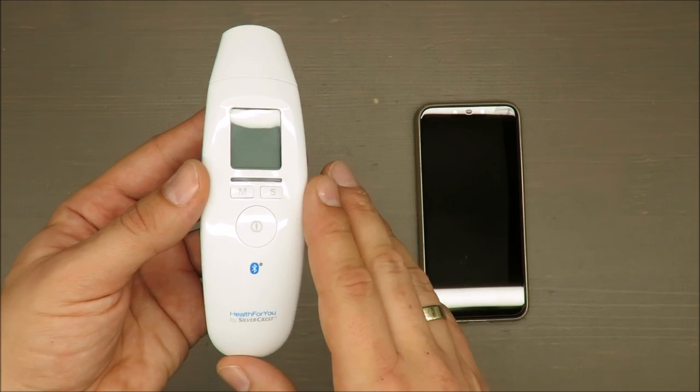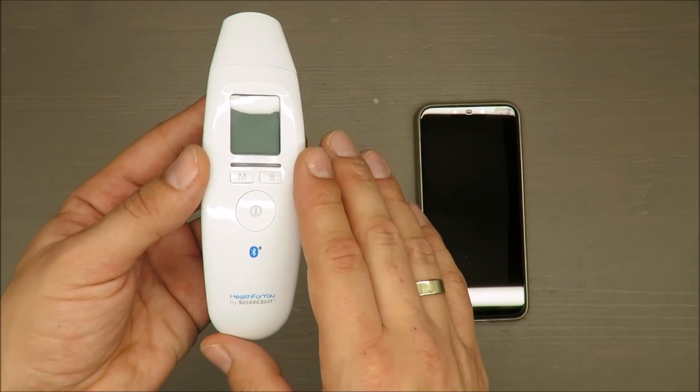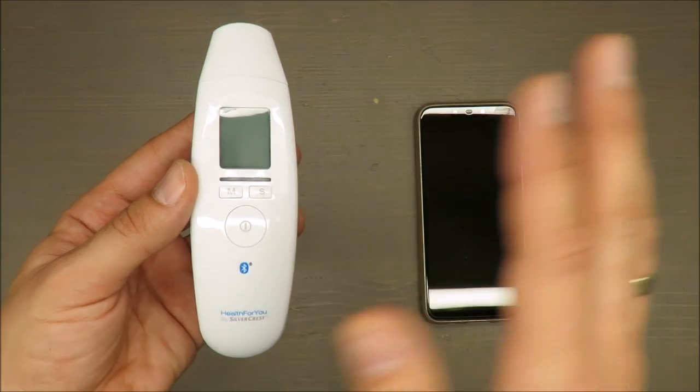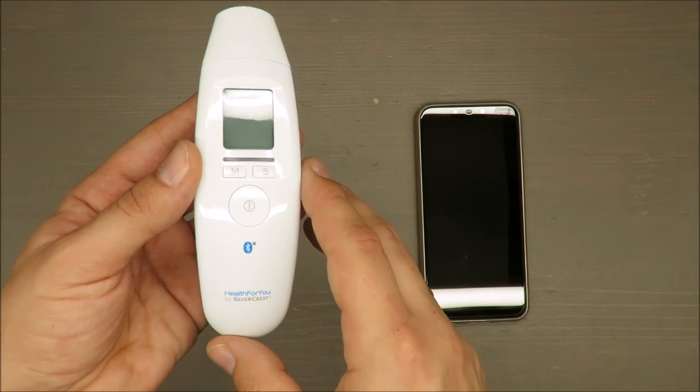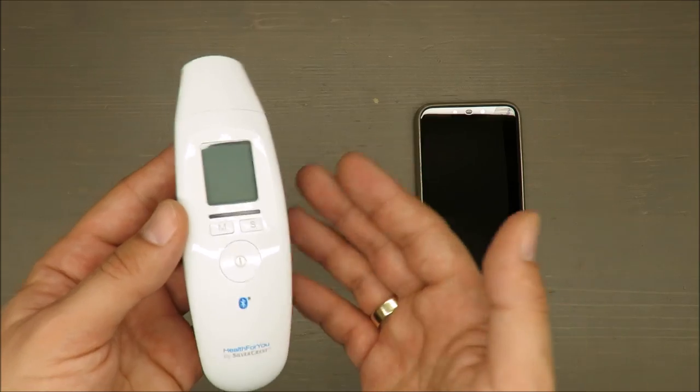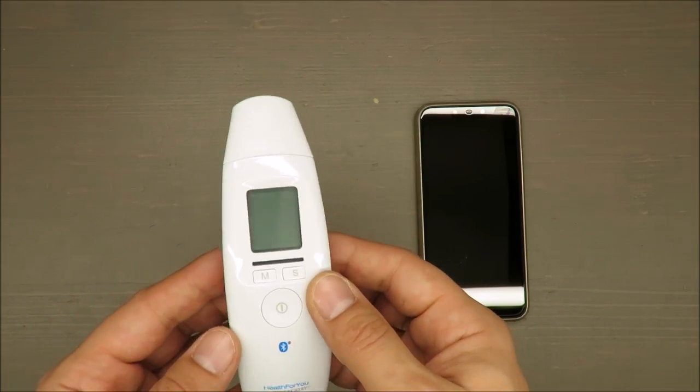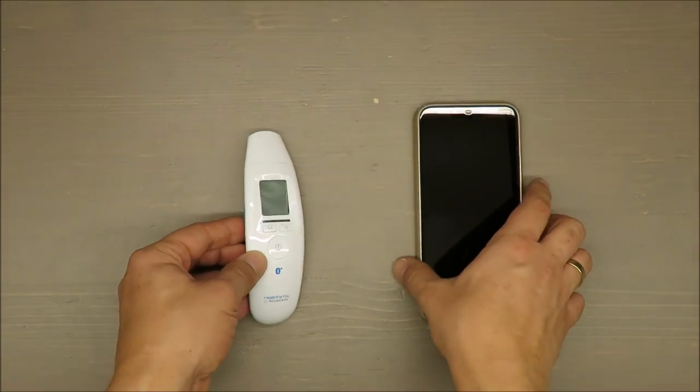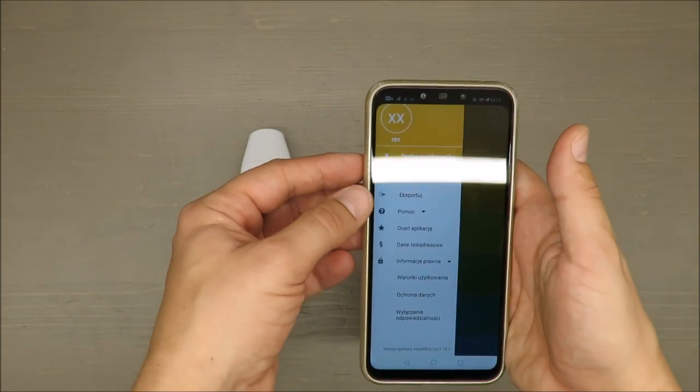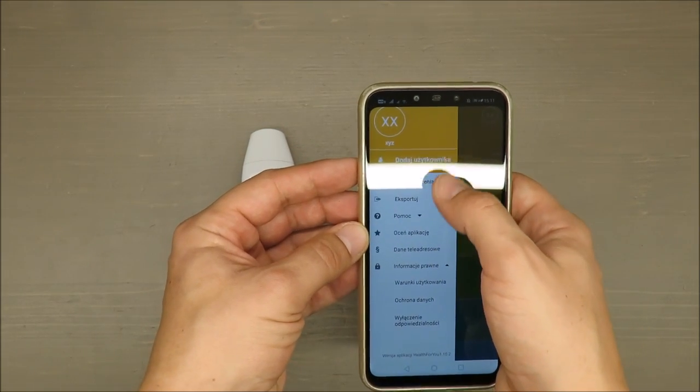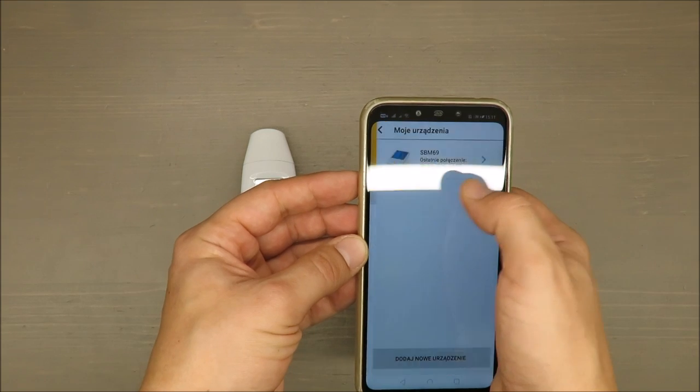It has Bluetooth connectivity, stores up to 30 records, date and time display, and it can switch between Celsius and Fahrenheit. So without further ado, let's try how fast it will be.